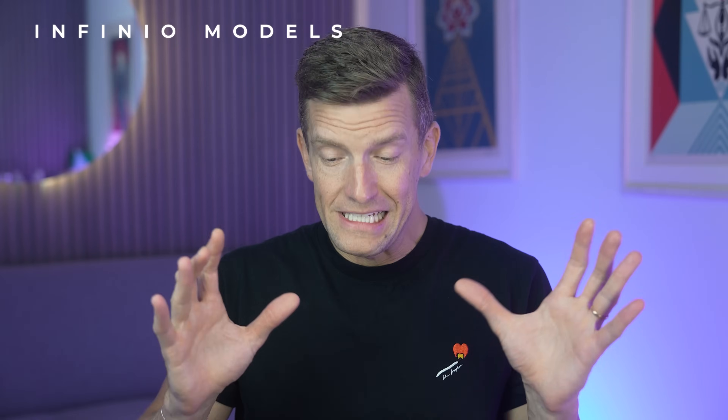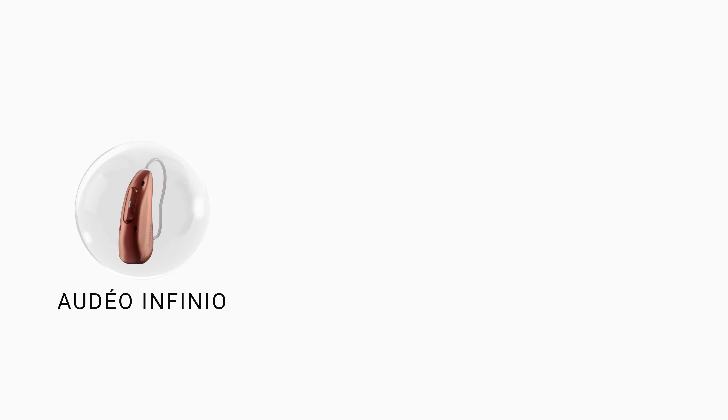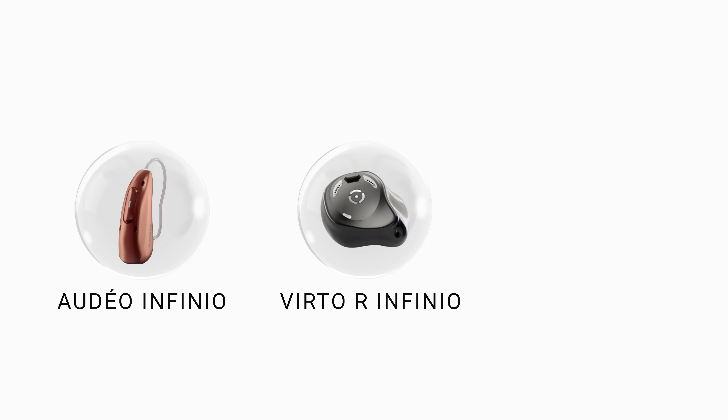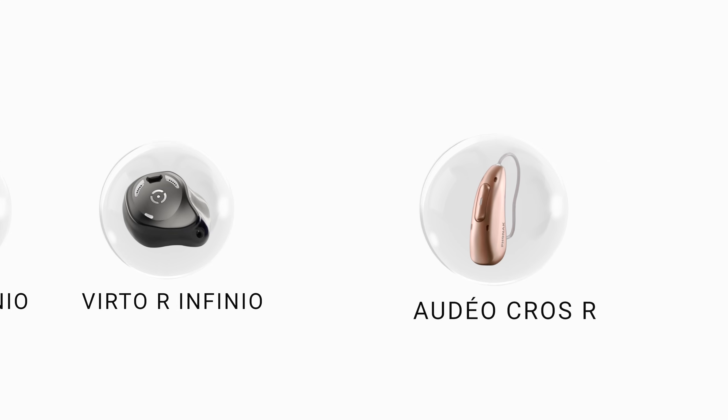At the time of making this video, which is pretty much launch day, Phonak Infineo is available in three different models. Firstly, the Audeo Infineo, which is their rechargeable receiver-in-canal style, essentially designed for versatility, suitable for a range of different hearing losses and loaded with plenty of new features. Secondly, we have Phonak's first ever rechargeable in-the-ear hearing aid, the Virto R Infineo. And I have to say these things are absolutely beautiful — they support directional microphones and definitely win the award for the coolest looking. Finally, Phonak have a new Audeo Infineo Cross, specifically designed for those with a unilateral hearing loss who need a cross or bicross setup.